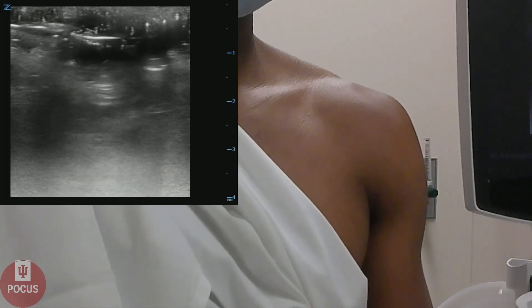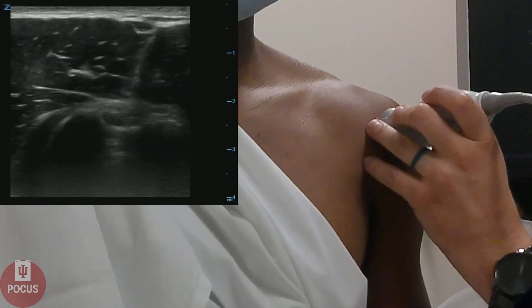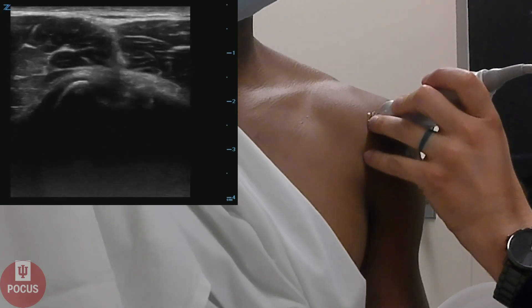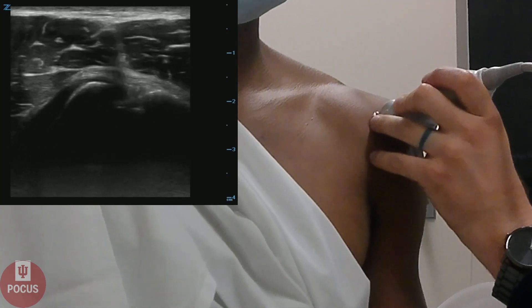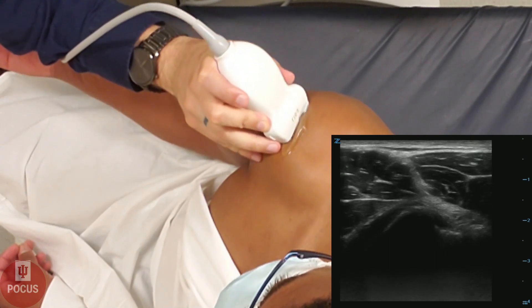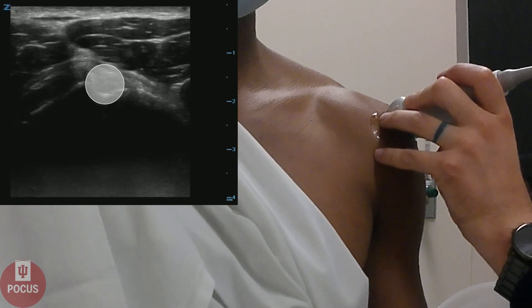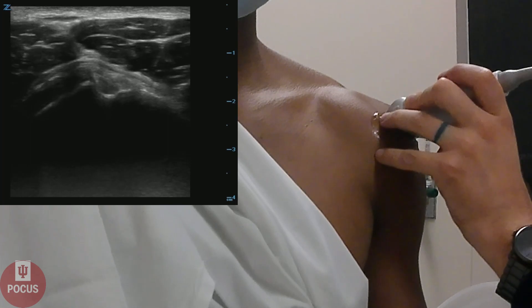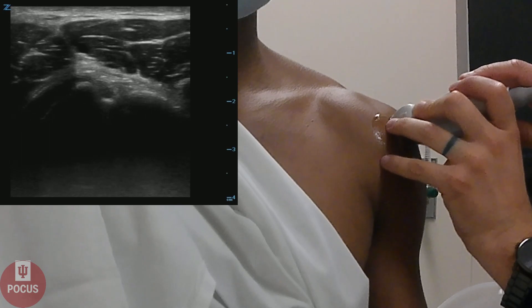Then we'll first palpate and look for the biceps tendon. We'll place the probe in a transverse position and try to find the biceps tendon. This patient has a myotendinous junction between his deltoid muscles, so we'll have him rotate his arm just a little bit so that we can better identify his biceps tendon. And there it is right in the center of the screen. We can wag the tail of the probe back and forth and see the anisotropy of that tendon as it appears and disappears — so don't mistake it for a missing tendon.